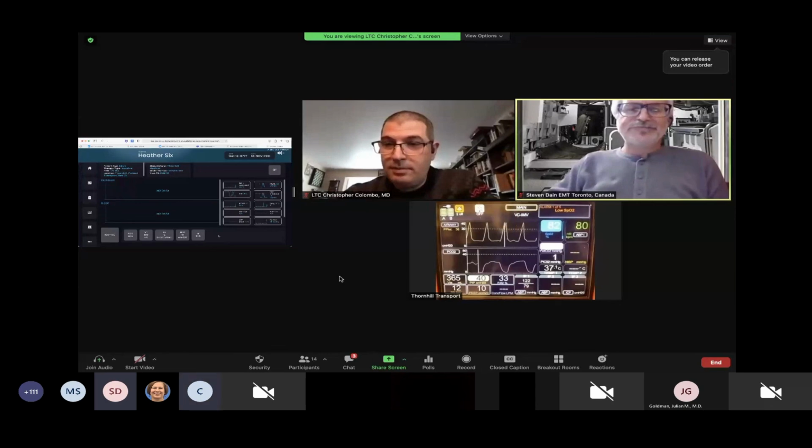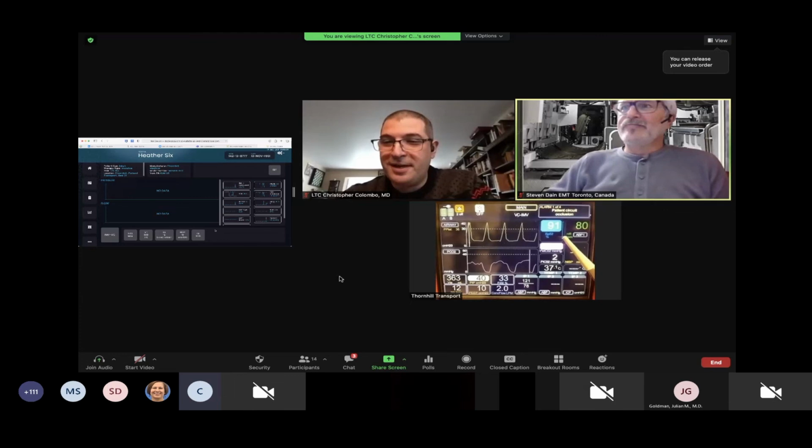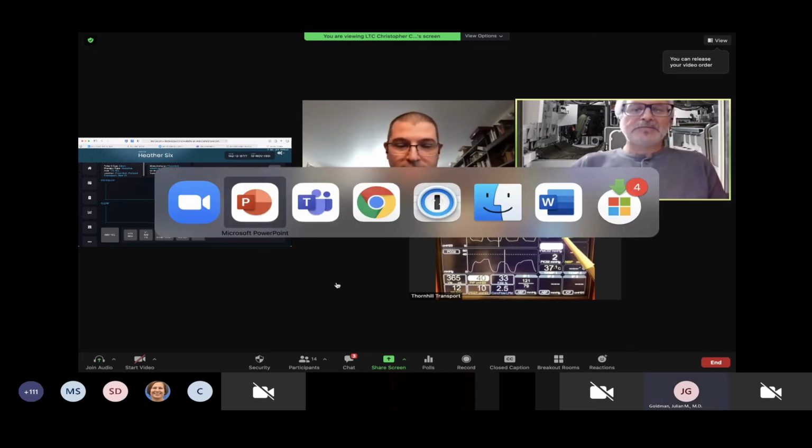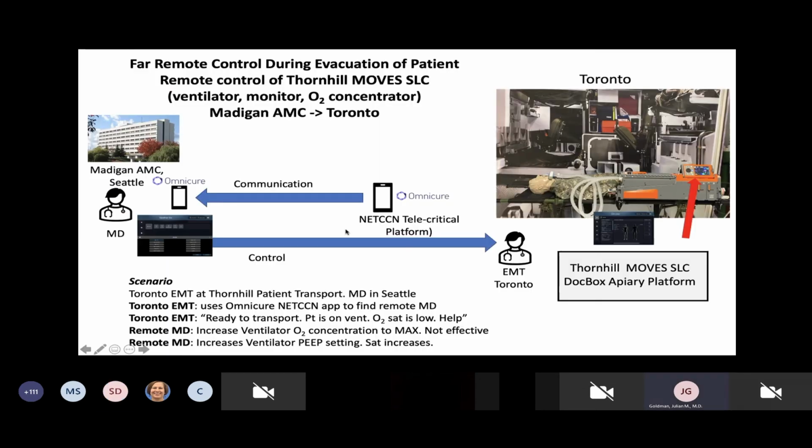Okay, thank you very much. Okay, and I will send you documentation of that in the app and a summary of the recommendations we have and what we've done today. And here, I see we're above 90 again. We'll stick with you. We'll be available as you need us. Thank you very much. Okay, have a good day. Simulation. Thank you very much from Toronto and from Seattle.